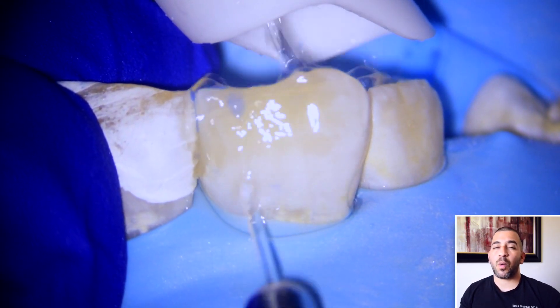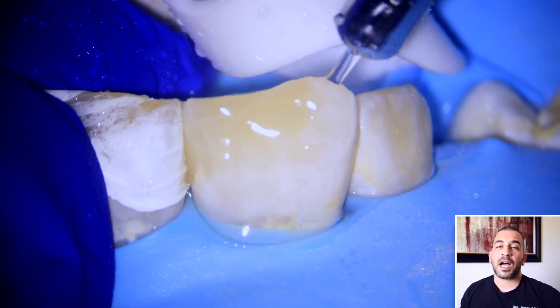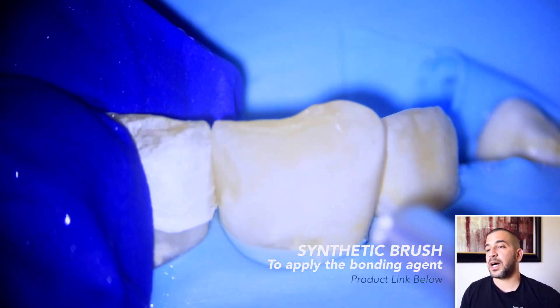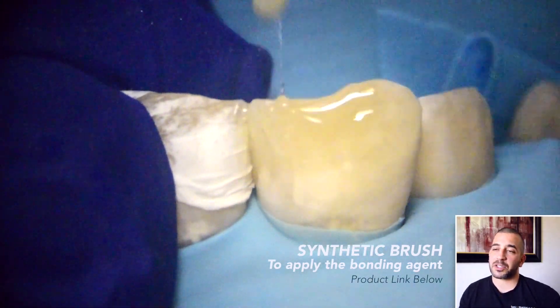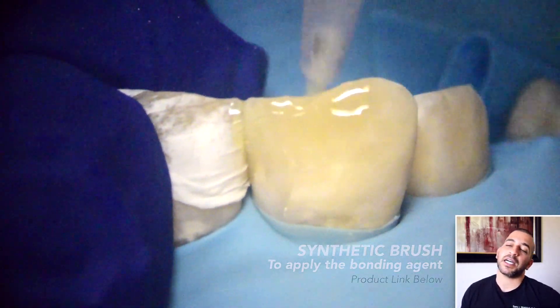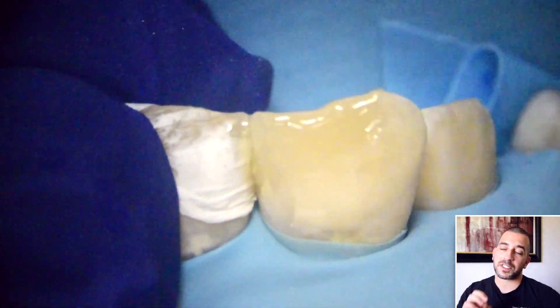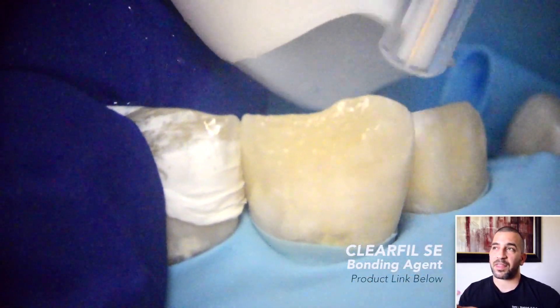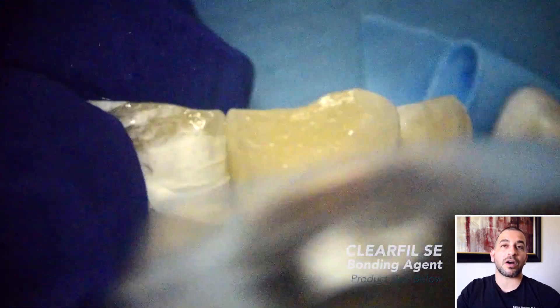Then you're going to wash and dry it out completely. You don't want it too dry but you also don't want any moisture on it before you place your bonding. I like to use a synthetic type brush when I place my bonding agent on front teeth — you can also use a micro brush; it really depends on the tooth. I dip my brush in the bonding agent and then flow it all over the tooth anywhere where the phosphoric acid etched and touched, and a little bit beyond. Of course we do air dry it thin — we don't want a thick bonding layer before you place your composite resin — so we air dry it thin, then cure it, and then place our composite resin.